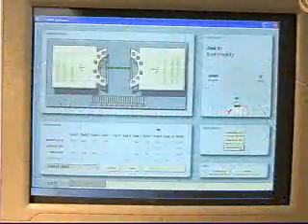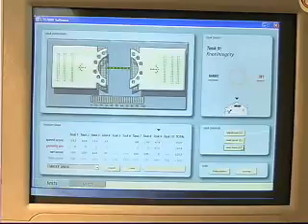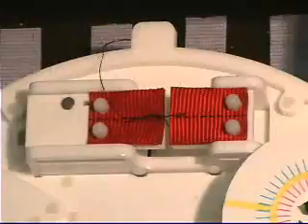50 penalty points are assigned for suture placed outside of the pre-marked area. A cutoff time of 480 seconds is assigned for this task. A score of 0 is assigned if the knot slips or fails the tensometer test, as shown here.